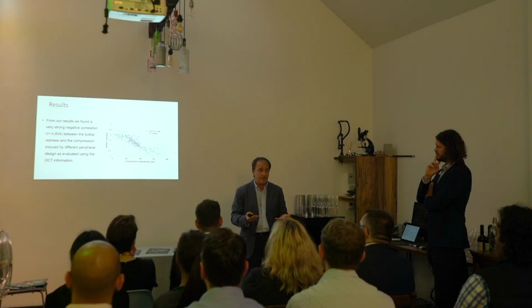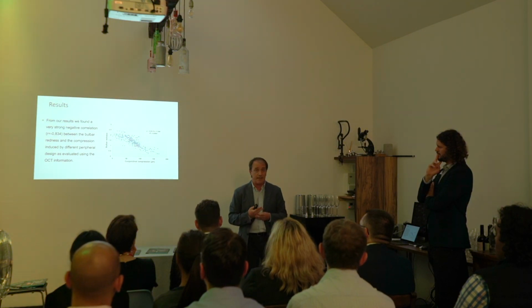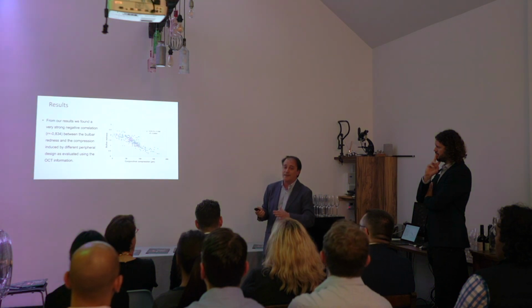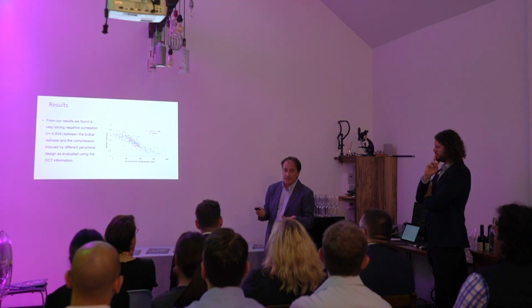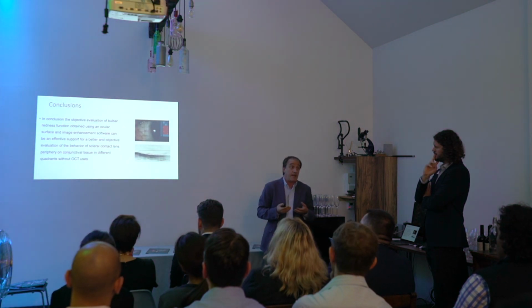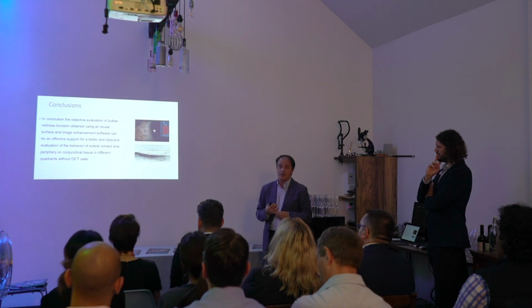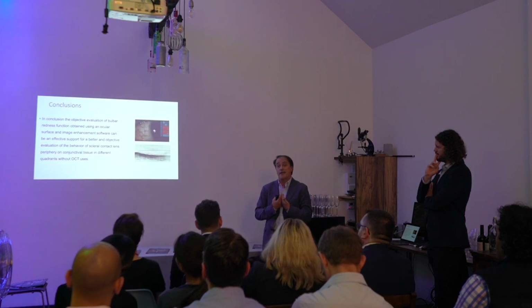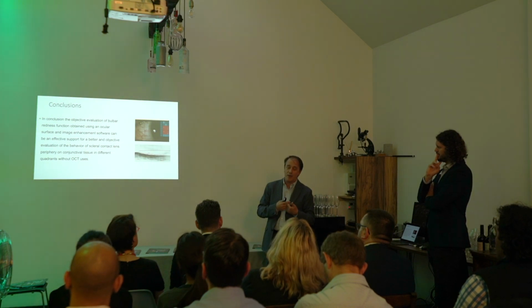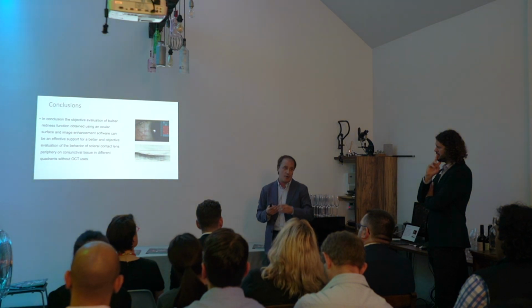And I think using software like AOS Anterior, it is not so easy to fit scleral lenses, but we do this in a more objective way, and we have more reliable results if we change, or we can control, check again our patient.